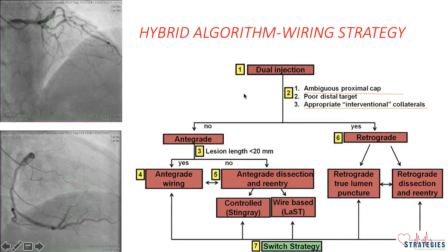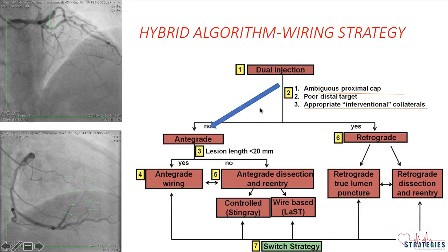Coming to the analysis of wiring strategy for this case keeping the hybrid algorithm in mind, we have not used dual injection as bridging collaterals are filling distally nicely. We took only left injection and there is an ambiguous cap with a good interventional collateral coming from RCA and distal target is okay. In this situation we can try antegrade because it is a short lesion. Success of antegrade wiring will be quite high, but to identify the entry point we may have to use intravascular ultrasound. We will wire with IVUS guidance, and once the wire goes true to true that is the end of the procedure, but if the wire goes true to false then we may have to use alternative ADR techniques to complete the procedure.